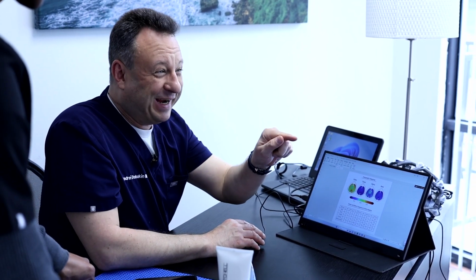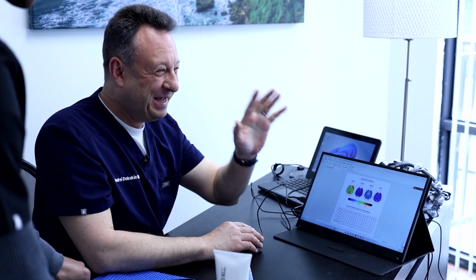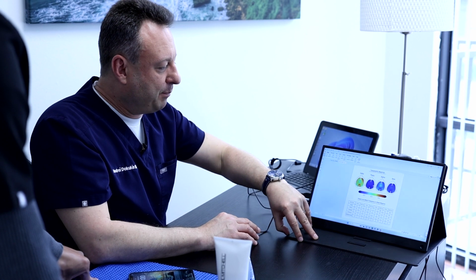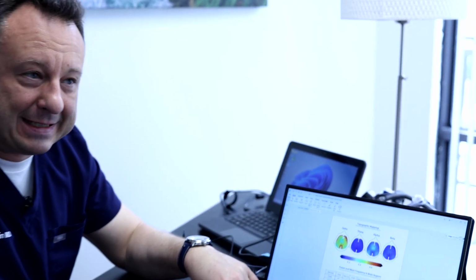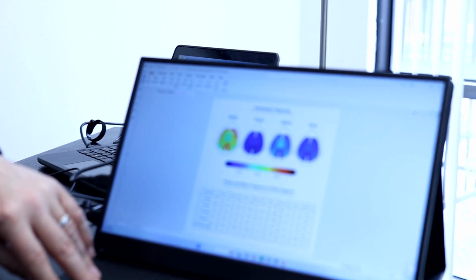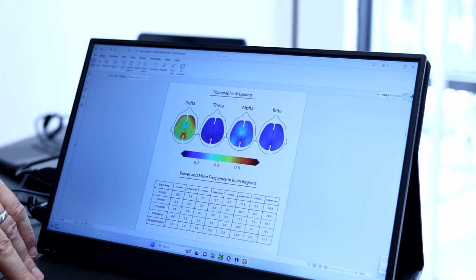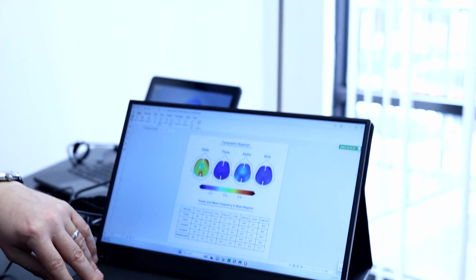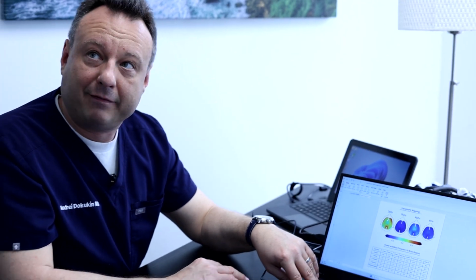This EEG is better. It is better, okay? It is better, but we still have a little bit too much of delta wave activity that you can see in the pinkish here. What that means is that at rest, while he is awake, some of the activity consists with sleep wave activity, with the sleeping delta activity. So what does that mean clinically? A person does not sleep very well, and the delta waves superimpose on the regular alpha waves. But this is much better than before, okay?